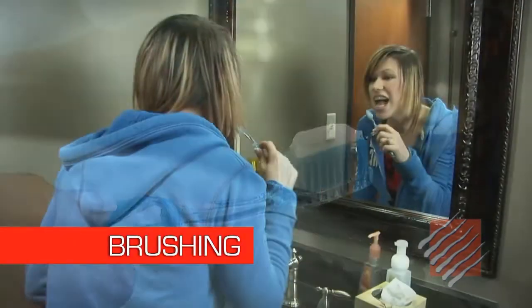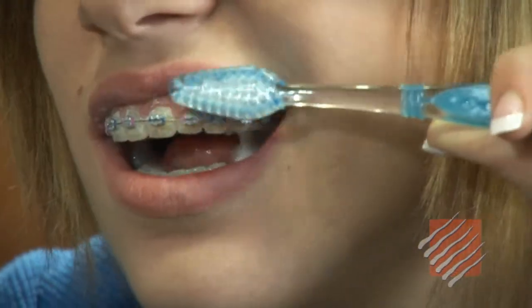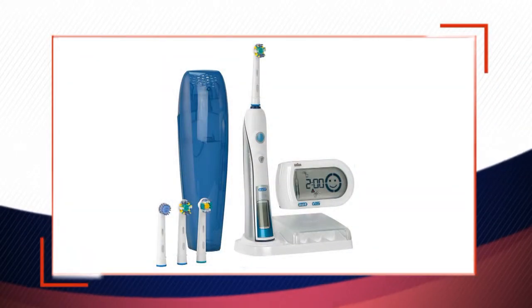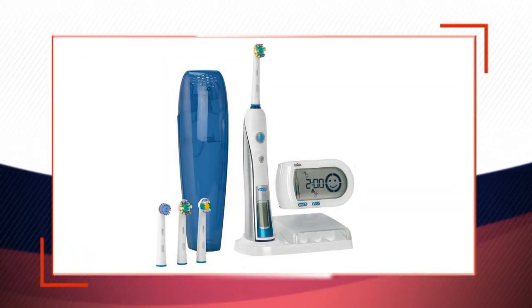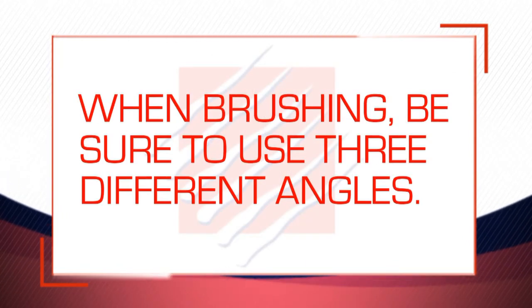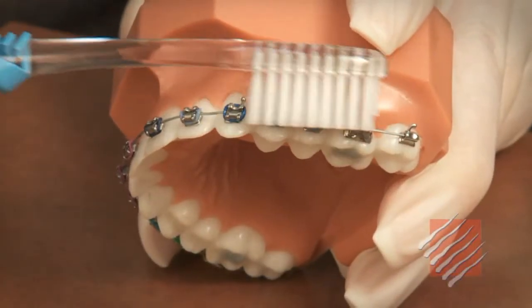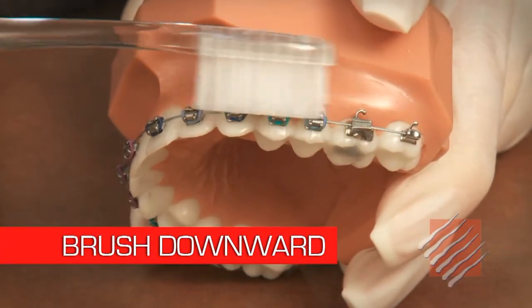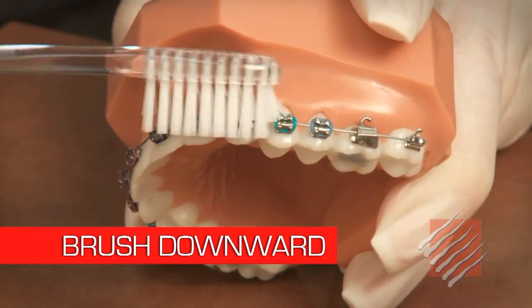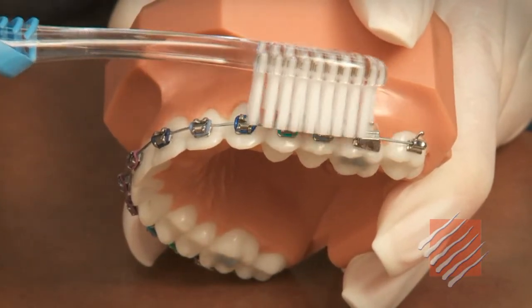Okay, now on with the how-tos, starting with the right way to brush your braces. For brushing, you can certainly use a regular manual toothbrush, or an electric toothbrush like a Sonicare or Oral-B brush will work fine as well. Remember that when brushing your braces, you'll want to use 3 different angles. Start by brushing down on top of the braces, placing enough pressure on the brush to get the tips of the bristles under the wire. Brush from one side to the other several times before you move on to the next angle.